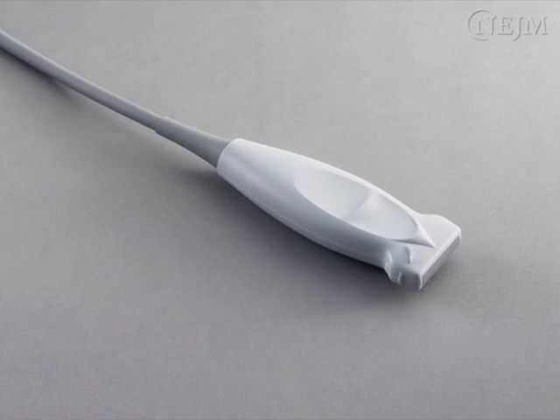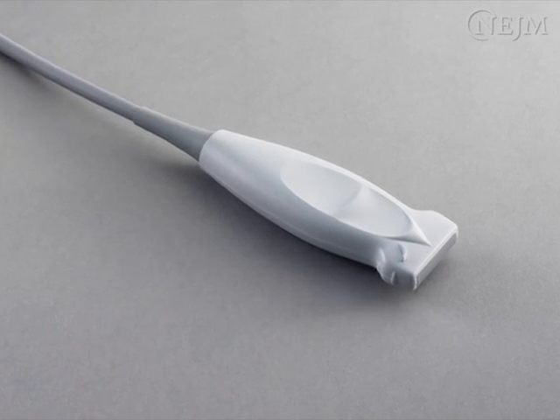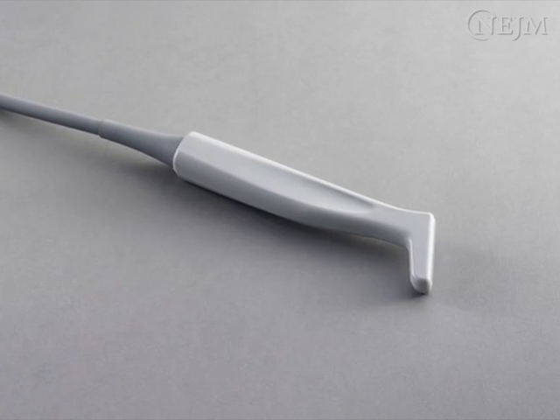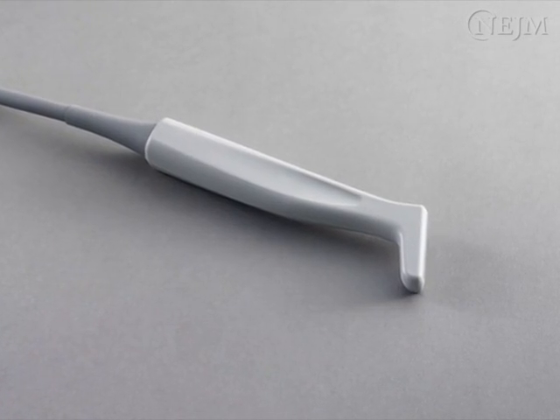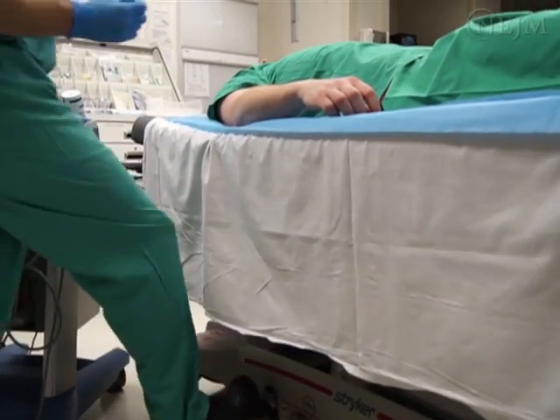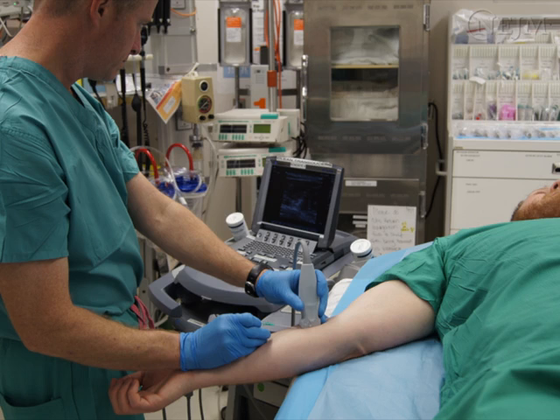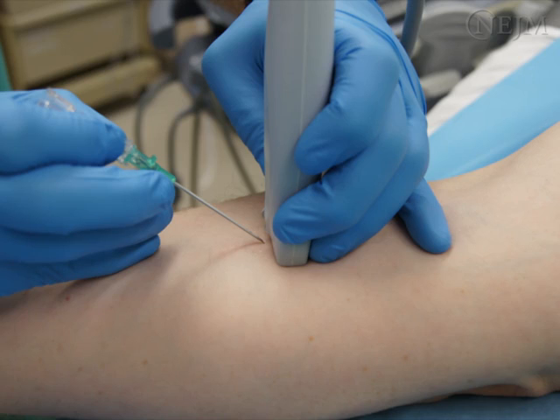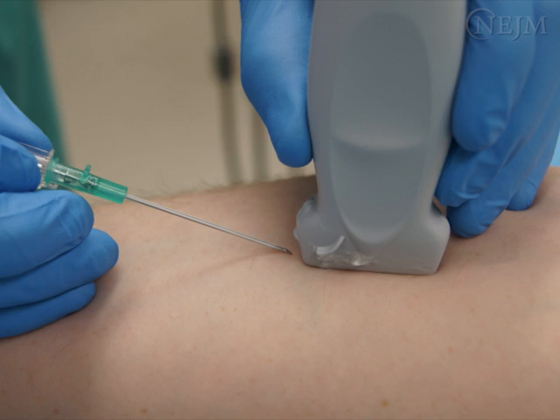A linear array transducer with a frequency of 5 to 13 MHz is usually used for ultrasound-guided vascular access. Short linear transducers are made specifically for ultrasound-guided procedures. It's best to place the arm in a horizontal position so the ultrasound images and needle movements are in the vertical plane. Elevate the bed or sit down so that you are not bending or stooping, but working with your hands comfortably in front of you. Place the monitor so you don't need to turn your head or look over your shoulder to see the ultrasound images. There are two commonly used techniques for ultrasound-guided vascular access, the transverse technique and the longitudinal or in-plane technique.